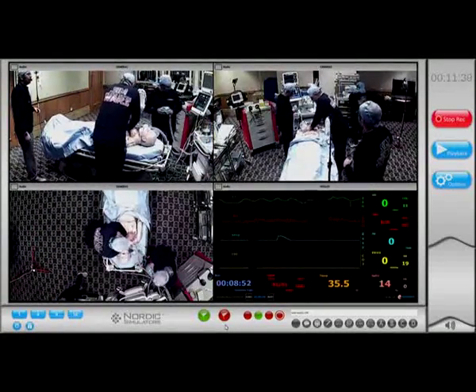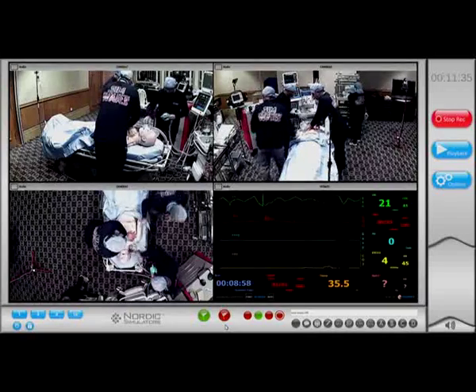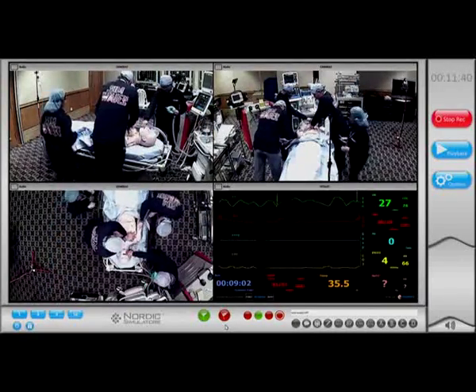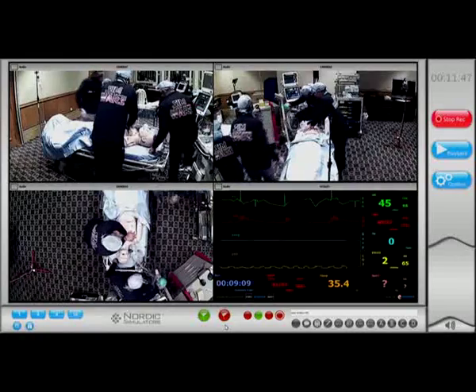Okay, I'm not able to ventilate. I'm not able to ventilate. I think we must put bilateral chest tubes. 2 minutes finished, Dr. Yasser. Okay. Bilateral chest tube, I will insert. Yes, bilateral, please. Shall I fix it for you? Yes. Okay. Another chest tube. Bilateral.